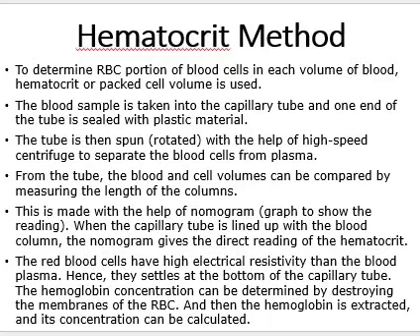What is this hematocrit, and why does it have to be measured? Everything we are going to discuss now. Hematocrit is commonly called HCT in labs. The doctor will suggest an HCT test.